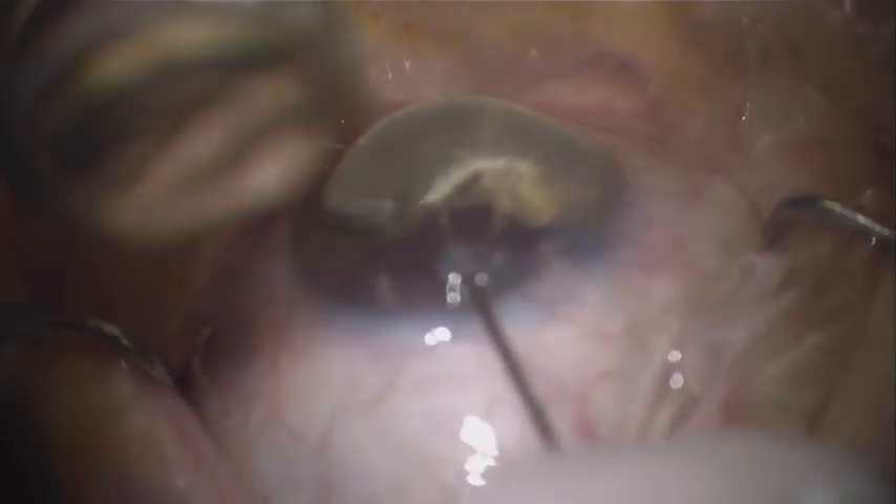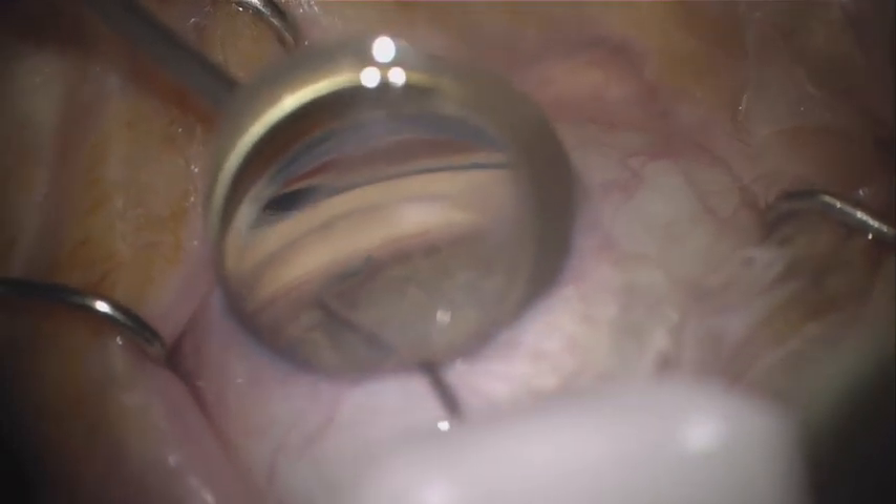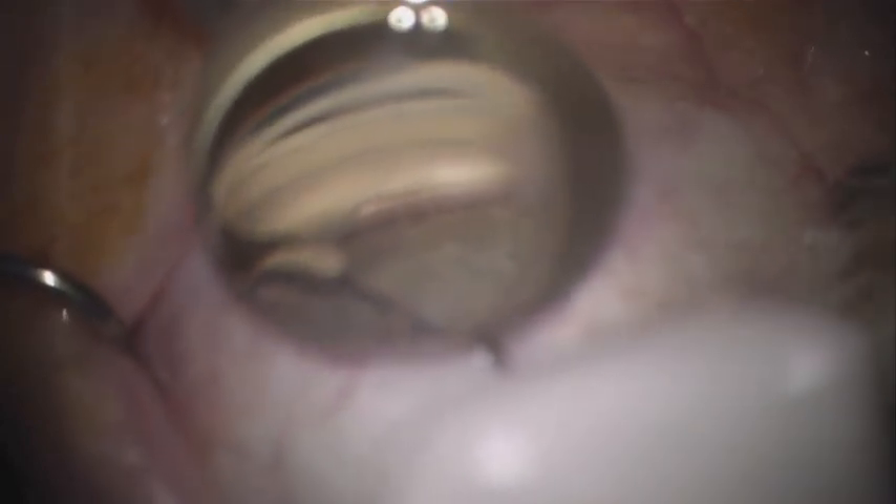We enter in and have a decision to go inferiorly. We'll take the tip, find the trabecular meshwork, and engage the tip into the trabecular meshwork with some pressure. Sometimes some wiggling action can help to get the tip of the Omni handpiece into the correct position through the trabecular meshwork and into Schlem's Canal.